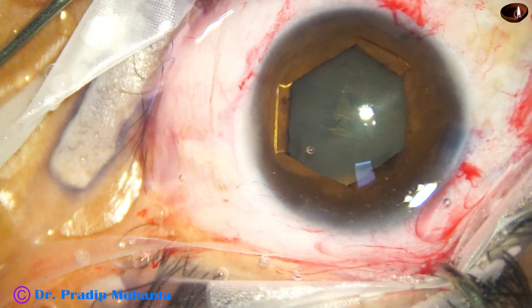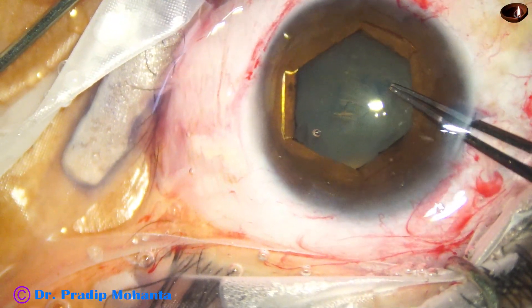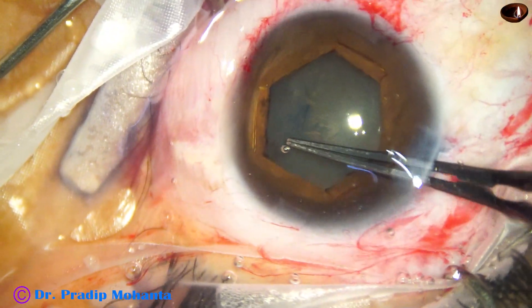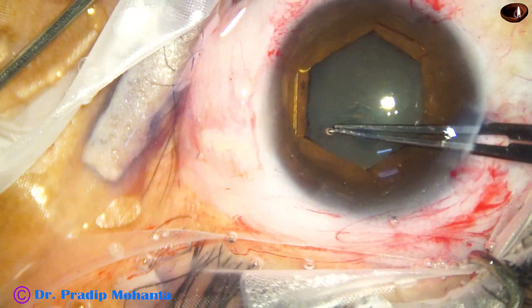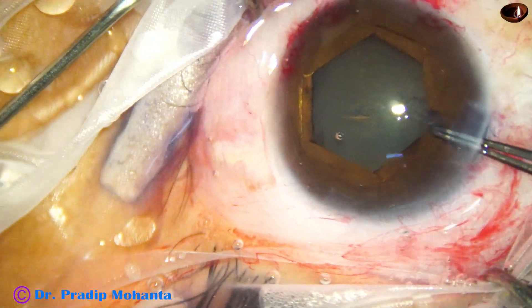Now I have cut open the anterior capsule at the center, holding a tag, and going anti-clockwise all around to complete the rhexis. And it is done.